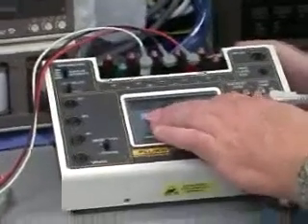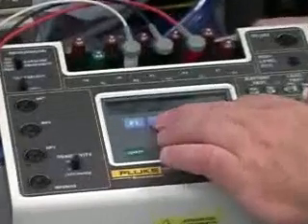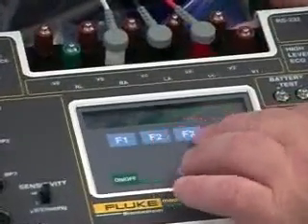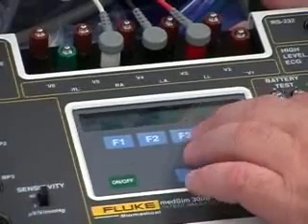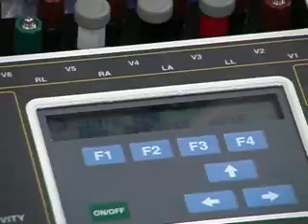Okay, so with ECG, there's full capability for modifying the baseline ECG in terms of rate from 30 to 300, and amplitude from 0.05 millivolts up to 5.5 millivolts. ST segment is a linear elevation or depression of the ST segment. That's something we use for looking at different stages of the MI.